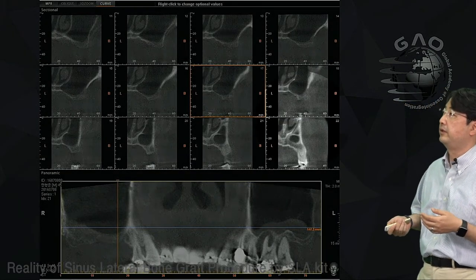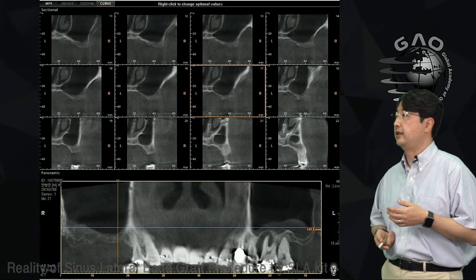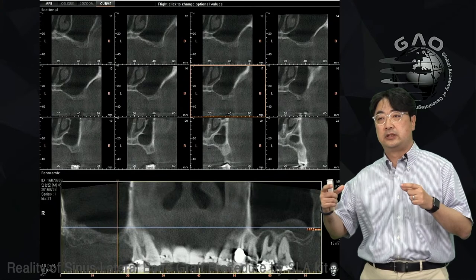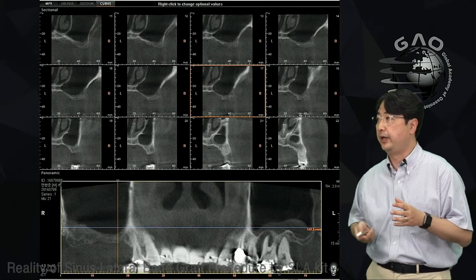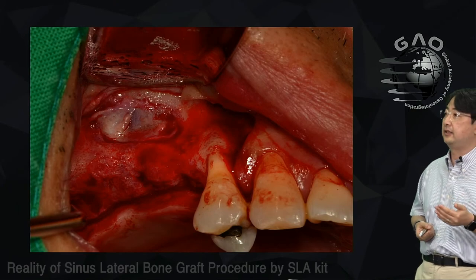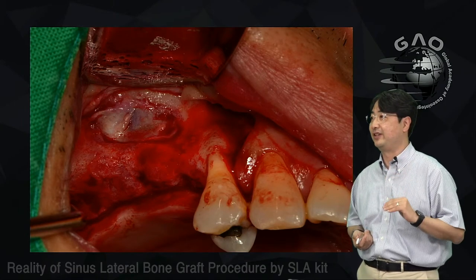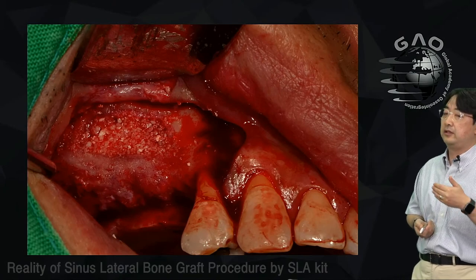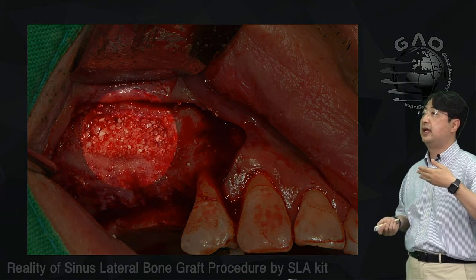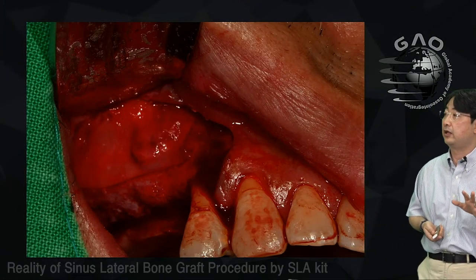So this is the panorama and CT scan. As you see, here is the opening on the anterior lateral wall, the window from the previous surgery. This is a clinical picture after I dissected the periosteum, and you see the periosteum and maxillary sinus membrane were sticking together, like this. And this is a clinical picture after I dissected the sinus membrane and did the bone graft, right? After that, I covered the anterior lateral opening with the PRF membrane.